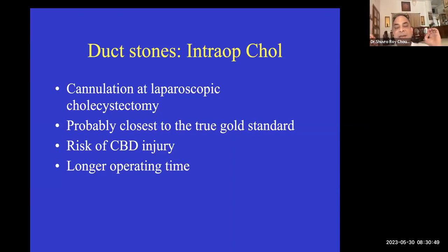So intraductal imaging, even a Spyglass, that is number one. Number two is, do have a look at the completeness of the Spyglass to investigate the whole of the bile duct. It is not so easy to look at the whole of the bile duct. Yes, very difficult. They are not able to look at the intrahepatic bile duct. Only the day before yesterday, I was talking about doing a Spyglass. We have Spyglass.